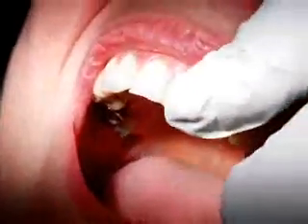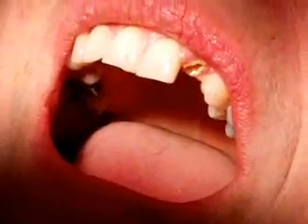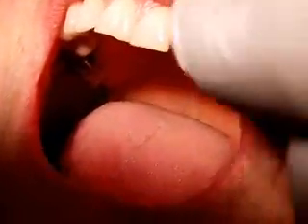We're recording? Okay, so we're going to infiltrate in the labial sulcus up here. We've got lots of topical on first of all, just to give a bit of surface anaesthesia.